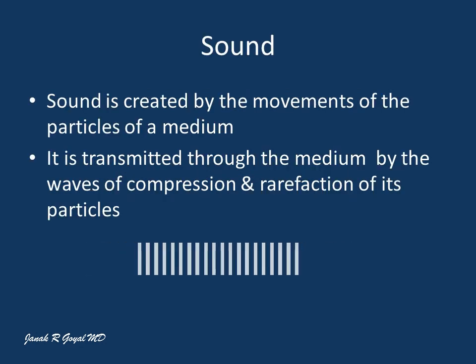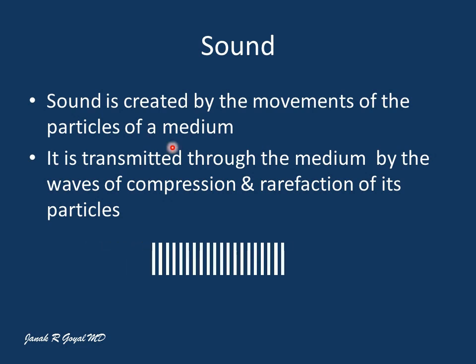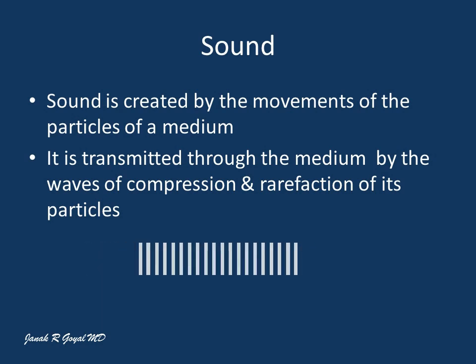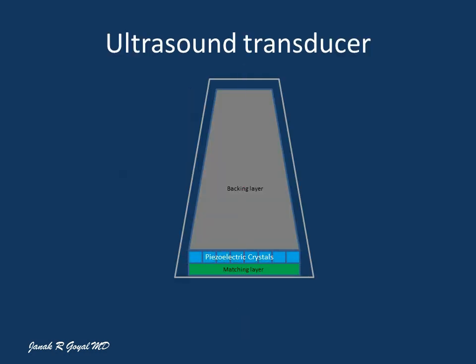Sound is created by the movements of particles of a medium, and it is transmitted through the medium by the waves of compression and rarefaction of its particles. The ultrasound transducer contains an array of piezoelectric crystals. The piezoelectric crystals vibrate when electrical current is applied to them. On the other hand, they generate electricity when they are mechanically deformed. And depending upon the clinical situation, the transducer is operated to produce either a pulsatile sound or a continuous sound.